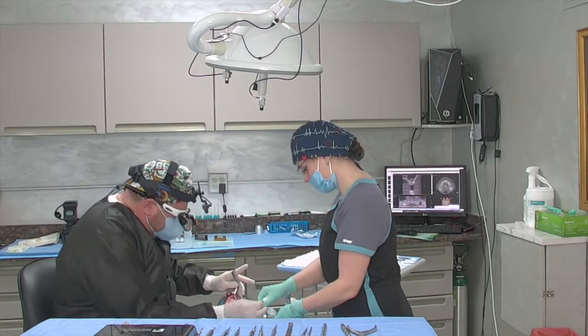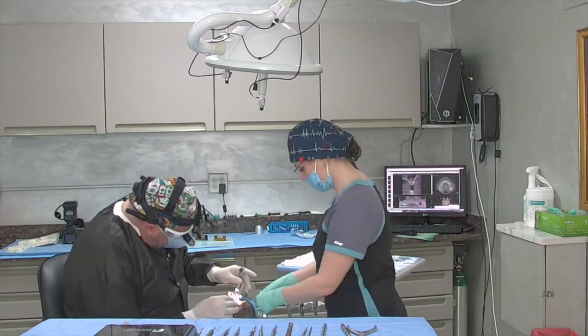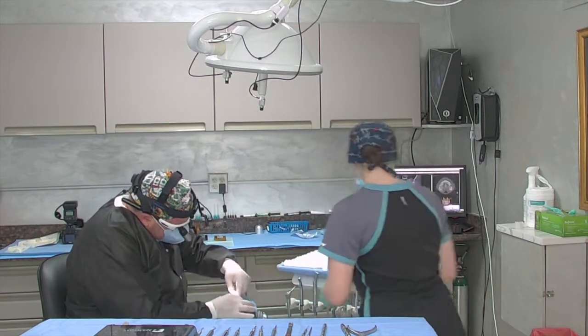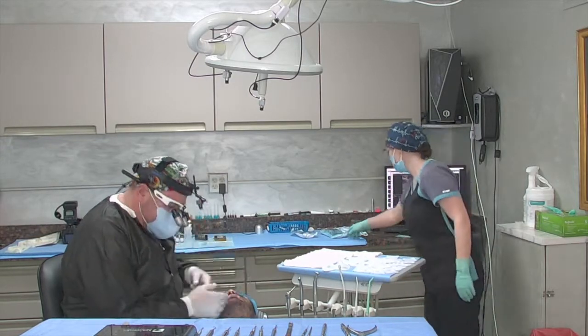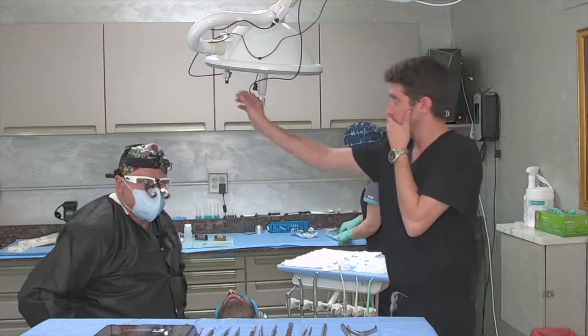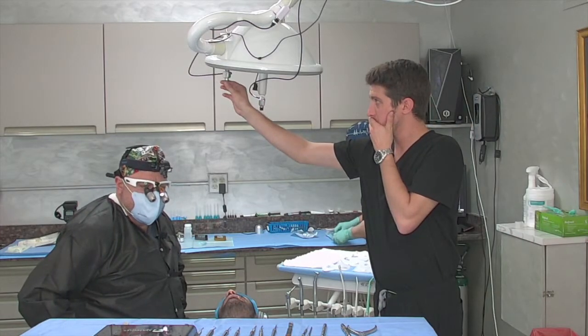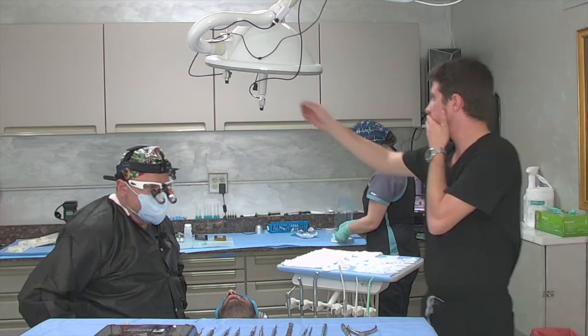We're also going to be doing some kind of neat things here, too, depending on how I get the site. Go ahead, bite down for me. Just relax for a second. Okay. We're going to be plumping the buccal tissue a little bit also between the implant and the graft. So I'm going to show you how we do this all from a minimally invasive approach.